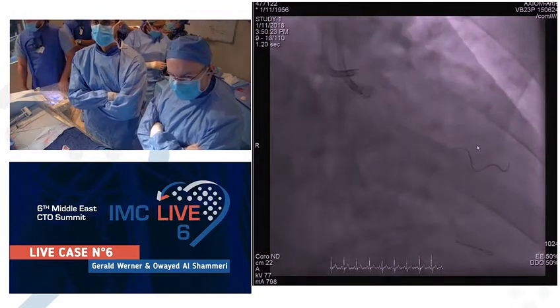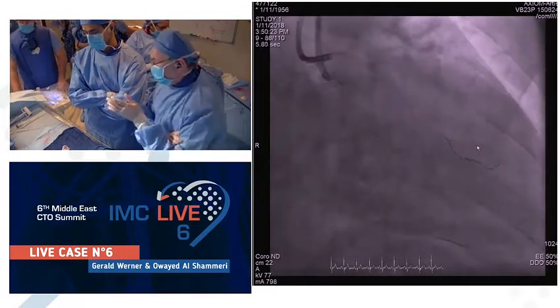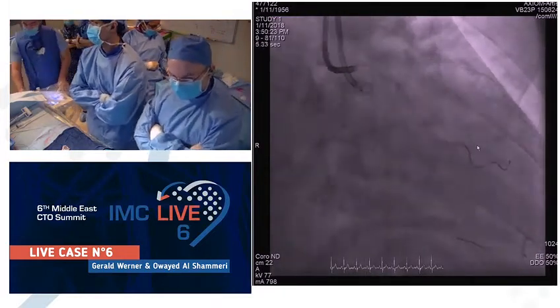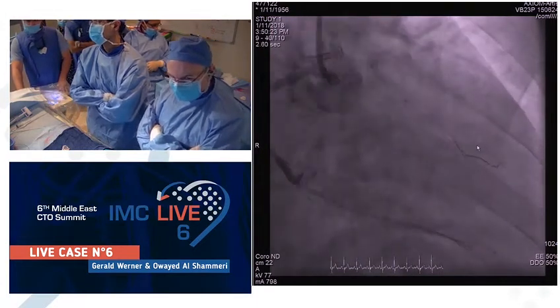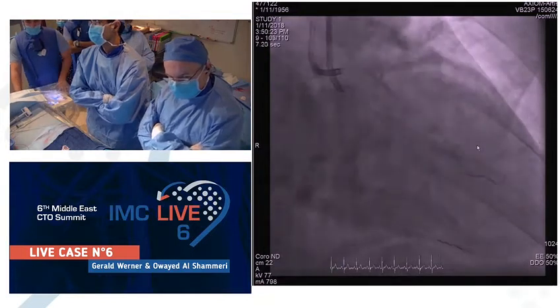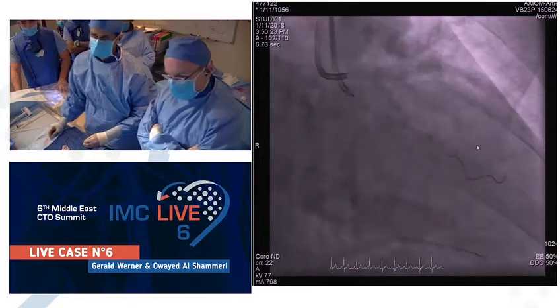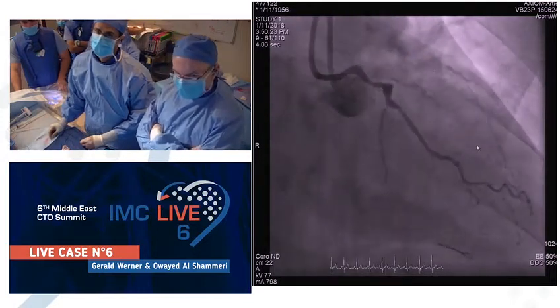We wanted to do IVUS for the left main, but it was evident that the left main is diseased, so IVUS was engaged with Alexandre. And I wanted to use the Volcano here because I wasn't sure whether we use it long for guidance or whatever. So in the meantime, what should we do? George, let's have a discussion. We already did something, but there are always many options. Would you go primarily retrograde, or would you try antegrade?